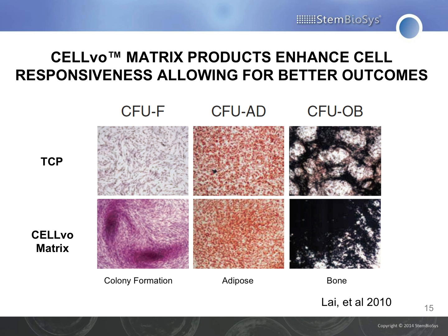And this is likely an index of those cells being in a foreign environment and trying to lay down an extracellular matrix, while when you put the cells on a natural substrate, not only are there places in the extracellular matrix to express and present growth factors and cytokines to the cells, it's just more effective, or we found it to be more effective in several instances.